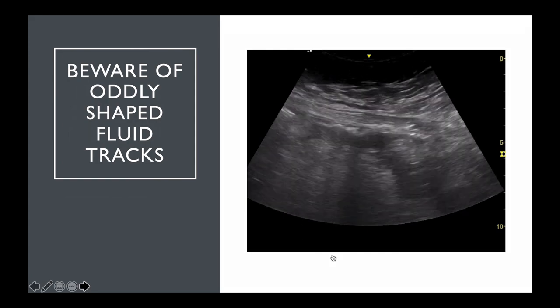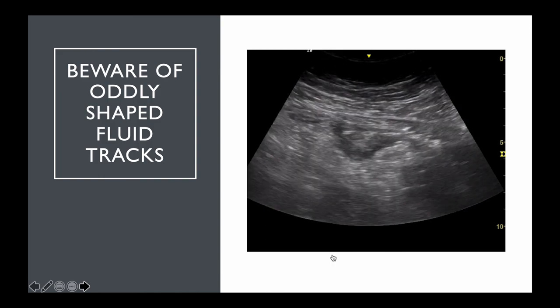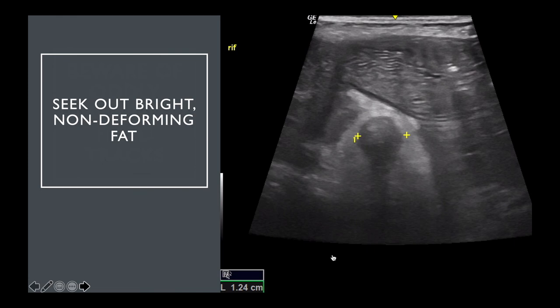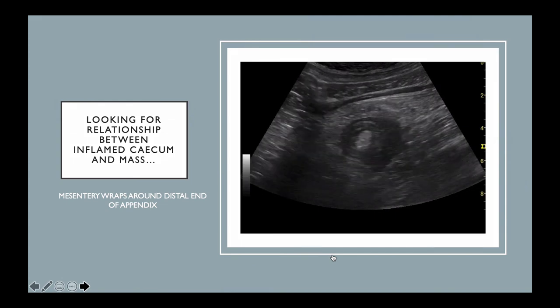And finally, when you have odd shapes of fluid tracking between bowel, not specifically free fluid, I think it's more like loculations of pus. This always concerns me. And finally, the appendiceal abscess is usually quite obvious because by the time the mesentery wraps around the necrotic appendix, it becomes quite bright and you can see it with a curved abdominal probe. Here's another picture and you can actually see mesentery wrapping around the end of the perforated appendix.